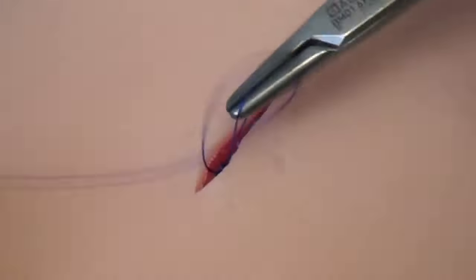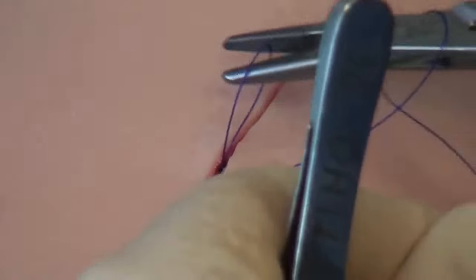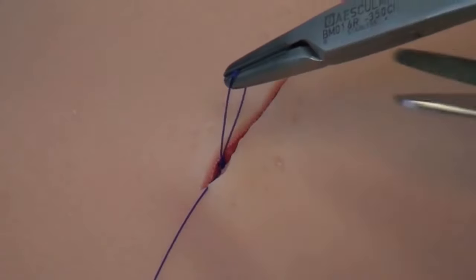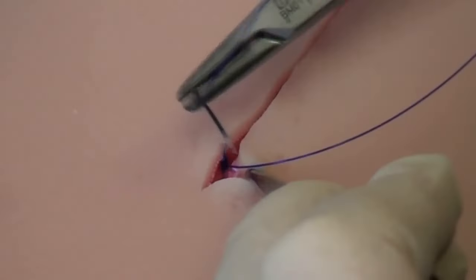When tightening the knot, make sure that the ends are directly opposite each other — this ensures a tighter fixture of the knot. When using a monofilament suture, seven knots are necessary, as monofilaments are relatively rigid. The end of the thread can be led through the side of the wound so that the knot is buried in the tissue.